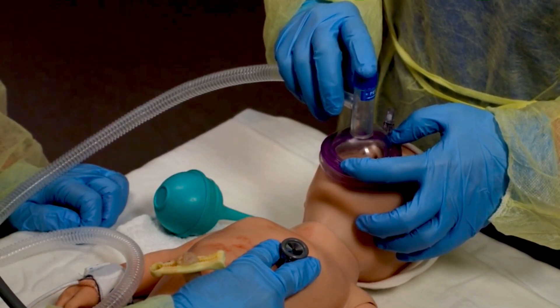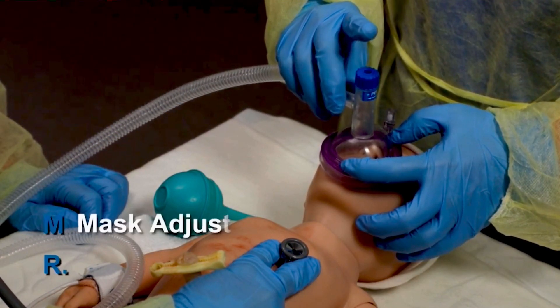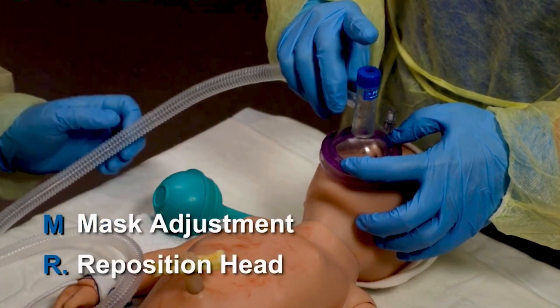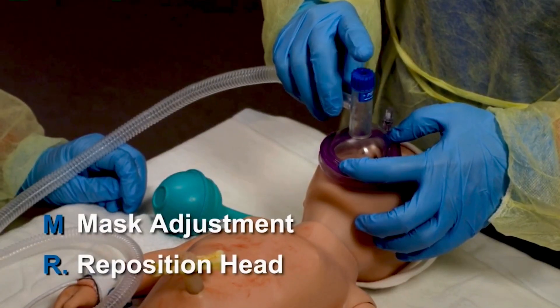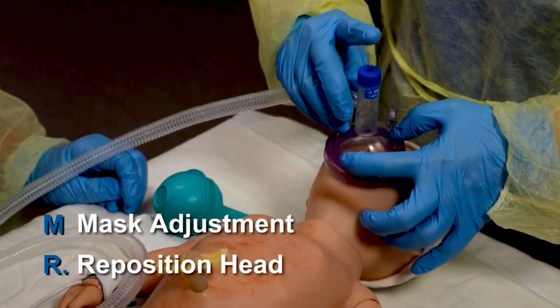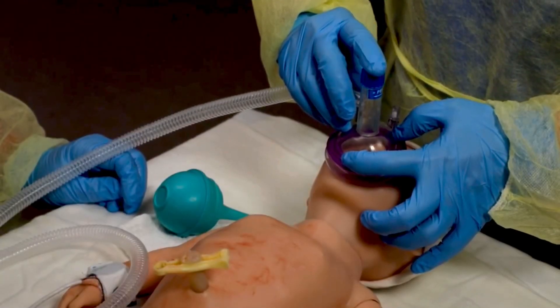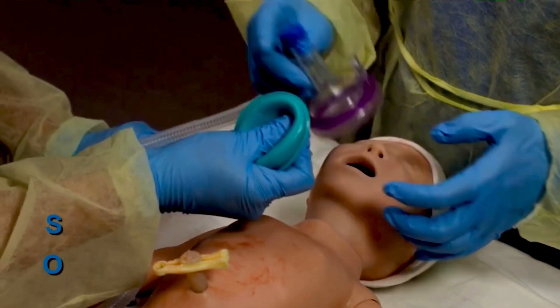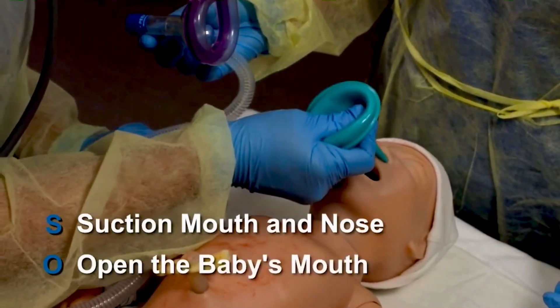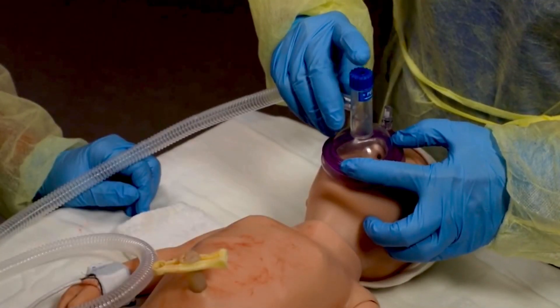Then give PPV for 30 seconds. M and R — mask adjustment and head repositioning — come first and often solve the problem. Adjust the mask and reposition the head, give several breaths and assess chest movement. If the chest still does not move with PPV, perform S and O: suction the mouth and nose and open the mouth. Again, give several breaths and assess chest movement.